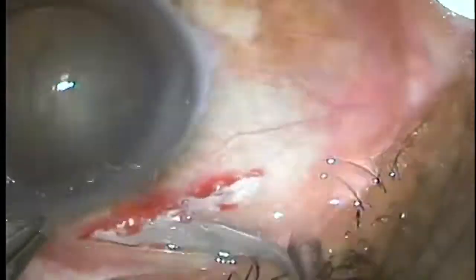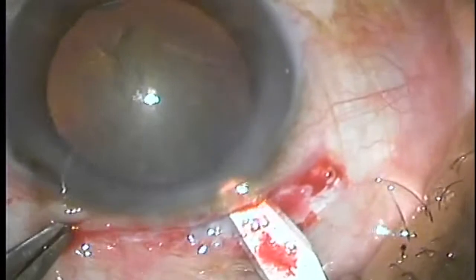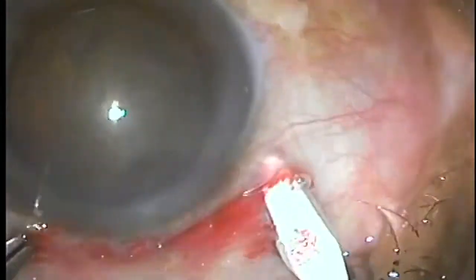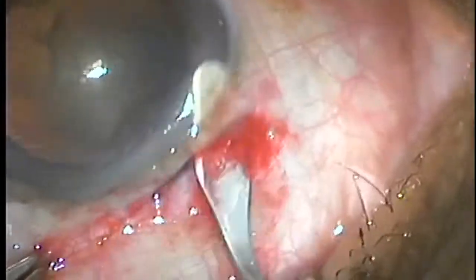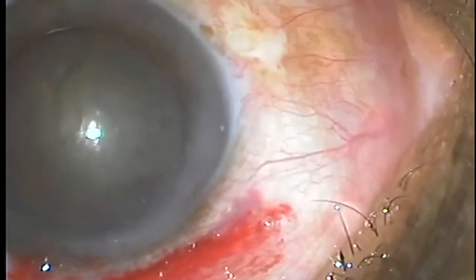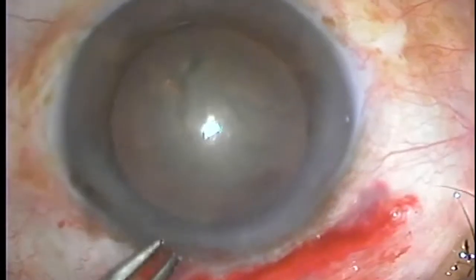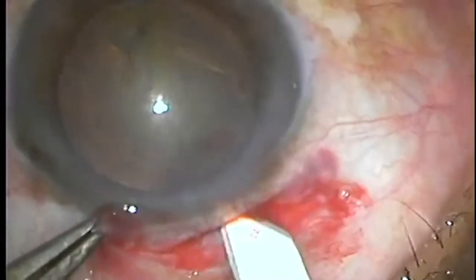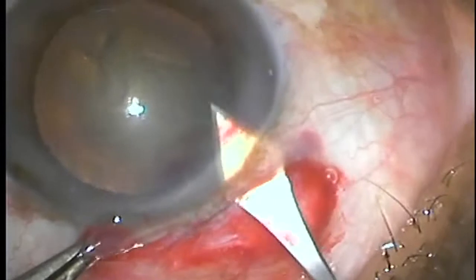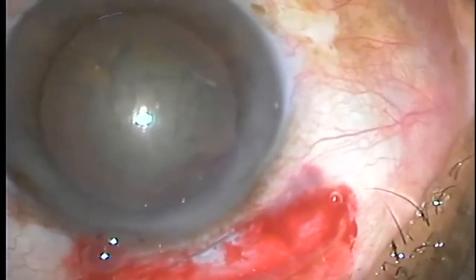A straight incision is made either in the superior temporal or superior nasal quadrant, and then a sclerocorneal tunnel is made. This sclerocorneal tunnel ensures that the nucleus quietly comes out through the anterior chamber. The anterior chamber is then entered with the keratome.